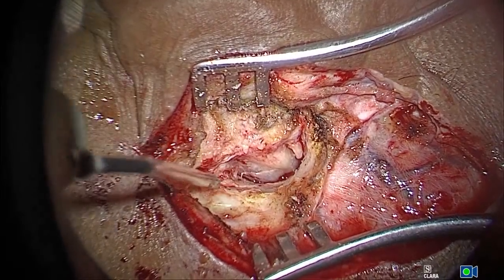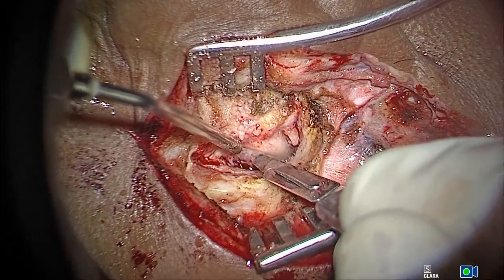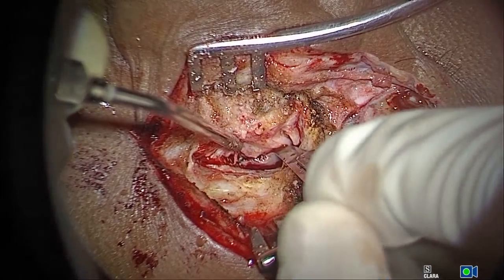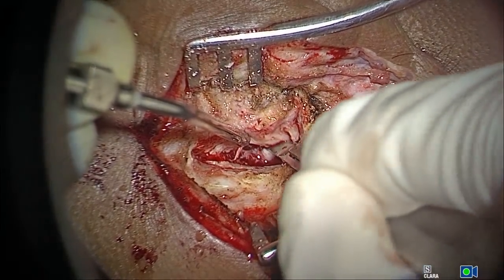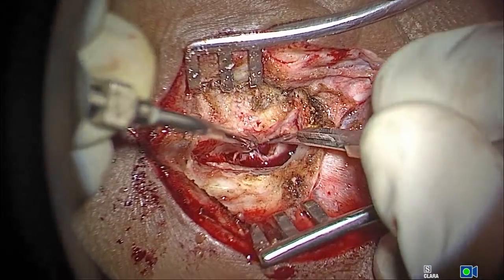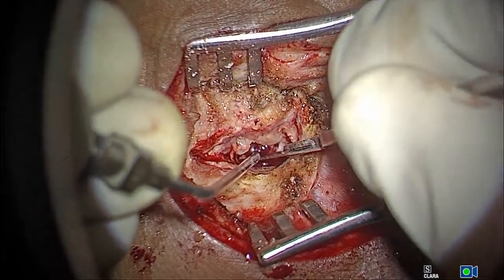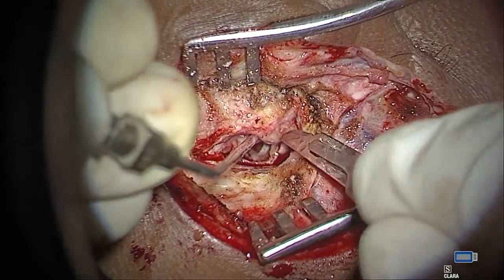What I'll do now is, give me a knife. So I'm going to now make the incision, that's called the meatotomy. Some people raise the Koerner's flap. I'm not very fond of the Koerner's flap. So here we are. Posterior canal wall skin is like gold. This I keep telling. So here I'm now making that incision far below the Henle spine. Marginal suction. Suction should be reduced because I always believe that the posterior canal wall skin is very, very important. It's like gold to me. I wouldn't like anybody tearing that flap or messing up with that flap.